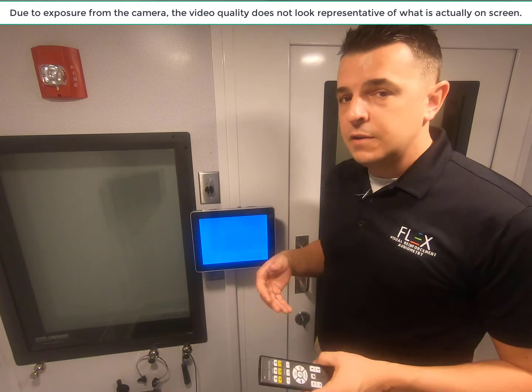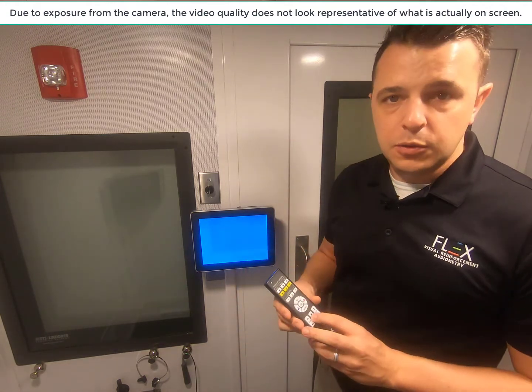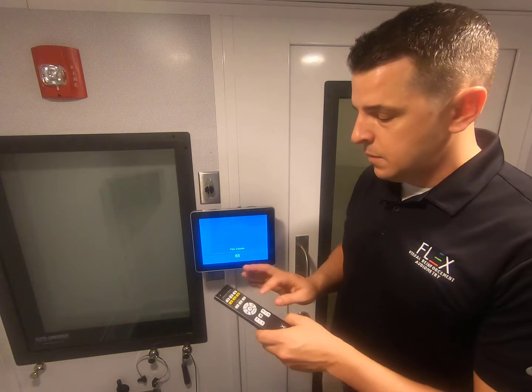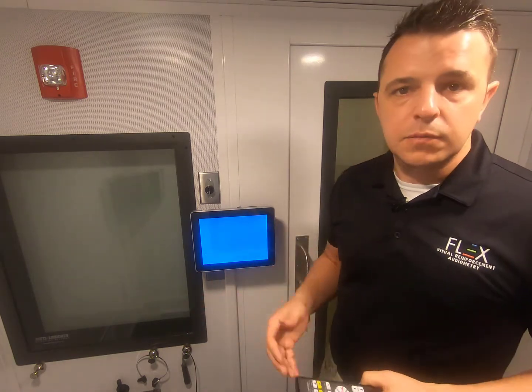And as you can tell, every Flex Basic comes standard with sound. We have full volume controls just like on the Flex VRA, which means you can have volume up and volume down to tailor that volume. You also have mute and unmute if you don't want sound on a particular patient.